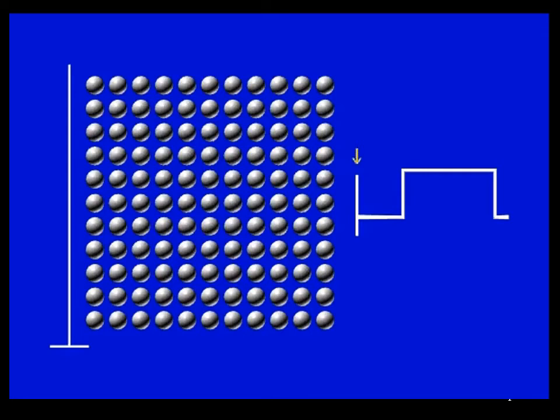In the previous slide, I illustrated how vertically oriented stripes of any spatial frequency could be achieved across the whole image by applying a gradient in the x direction. This slide illustrates that the same can be achieved with respect to horizontal stripes by applying a gradient in the y direction.